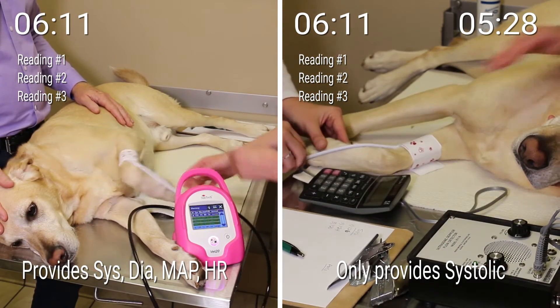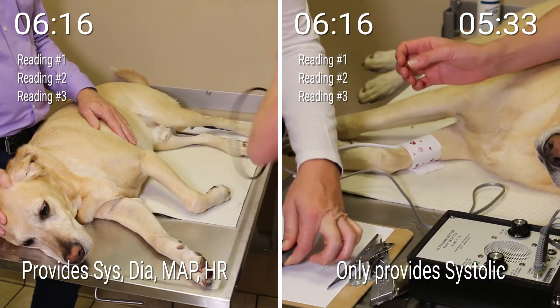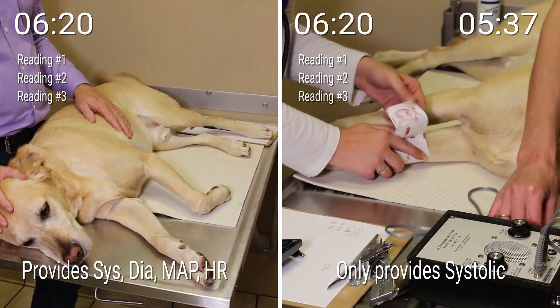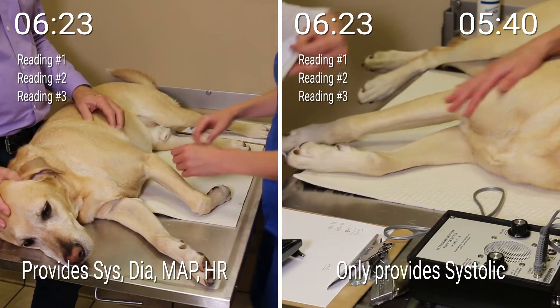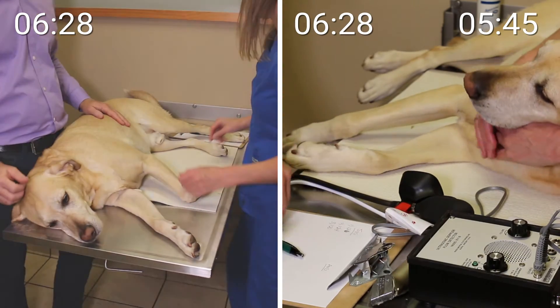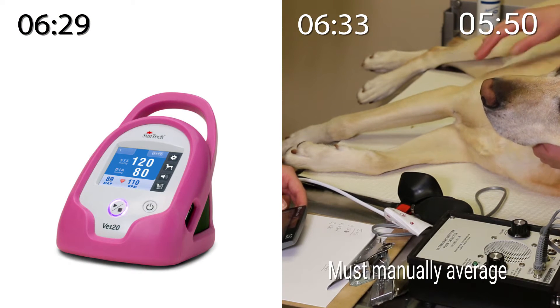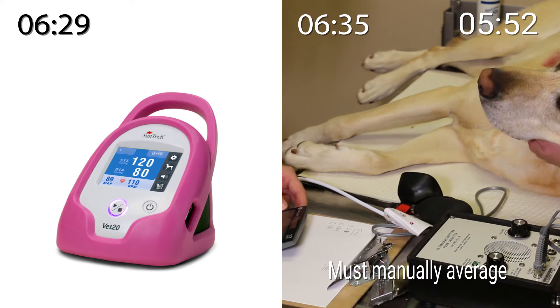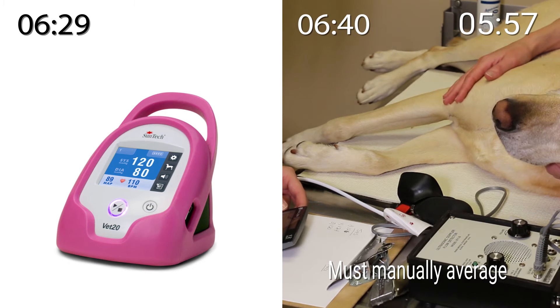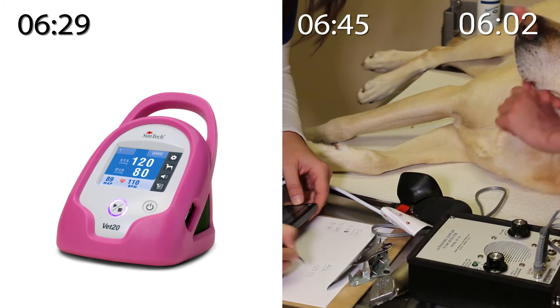On the right screen, you'll notice that the technician has just completed the third Doppler reading and now begins to take the cuff and probe off Tucker. The technician needs to find the average of the three Doppler readings. She goes back to the patient chart for the systolic values and uses a standard calculator to determine the average systolic value, which is then recorded in the chart. Doppler does not provide diastolic mean arterial pressure or heart rate.